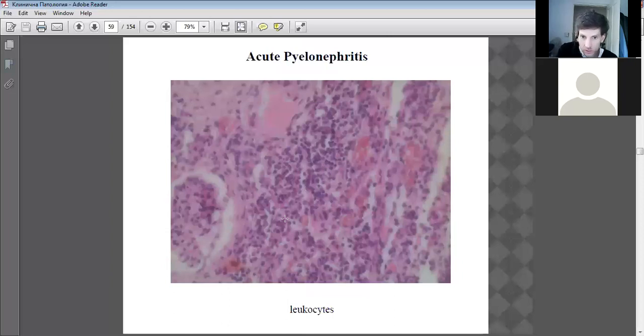I can't see many neutrophils as such, but you don't really need to mention the neutrophils, just the leukocytes. So more there, another one there, another one there. These are the slightly lighter nucleated cells.